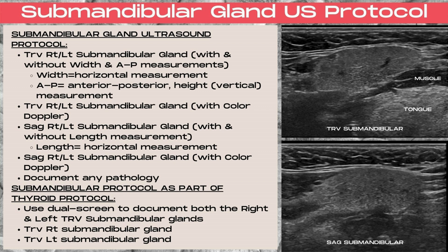You want to document any masses, stones, or other pathology that's visualized. To document the submandibular gland as part of a normal thyroid protocol, you want to use the dual screen control on an ultrasound to document both the right and the left transverse submandibular glands. Note that this corresponds to the right and the left of the patient's body, rather than the right and left sides of the ultrasound monitor.